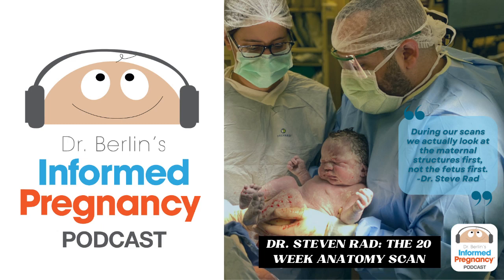You want to make sure that there's a complete spine from top to bottom, all the way from the neck down to the spine tip. Everything in the spine is closed up. One of the most common abnormalities we look for is spina bifida. It's rare, but one everyone's worried about. Make sure that there's no opening in the spine where the nerves are coming out, and that the entire skin line over the spine is closed.